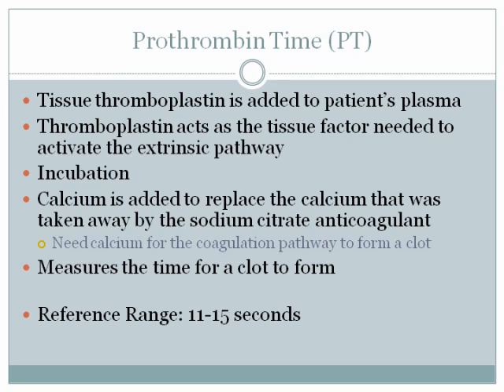All right, so how does the prothrombin time test work? Let's talk a little bit about reagents. The main reagent that's used is called tissue thromboplastin. Basically, this is going to act just like the tissue factor. Remember, in your body, the extrinsic pathway starts because of tissue injury and tissue factor becoming exposed. Well, we're going to mimic that setting in the lab. When we get somebody's blood sample in, we run their plasma, and we add in tissue thromboplastin, which acts like the tissue factor so it can get the extrinsic pathway started. That activates the extrinsic pathway.